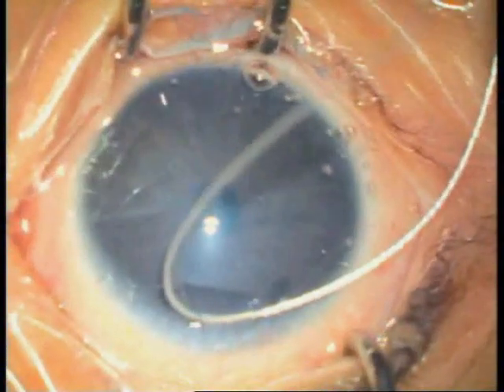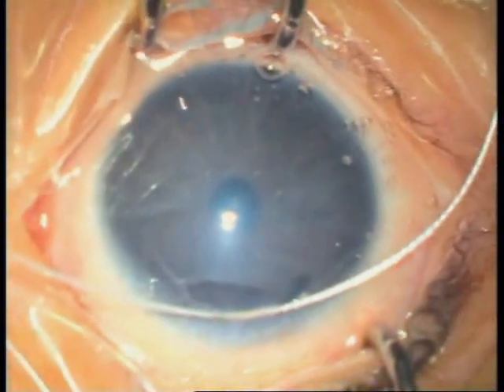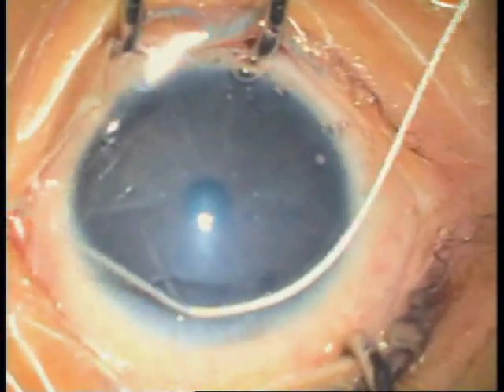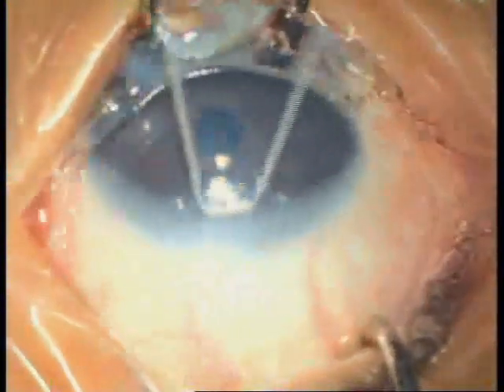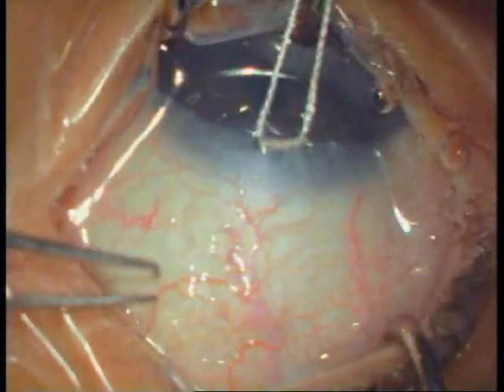Trabeculotomy is performed to remove obstruction caused by congenital angle deformity, and trabeculectomy is to bypass episcleral venous pressure. Releasable sutures provide titrability of aqueous flow postoperatively and excellent control of intraocular pressure.